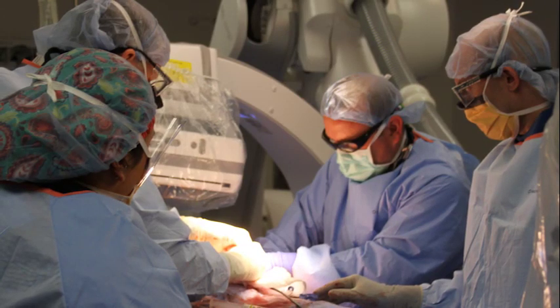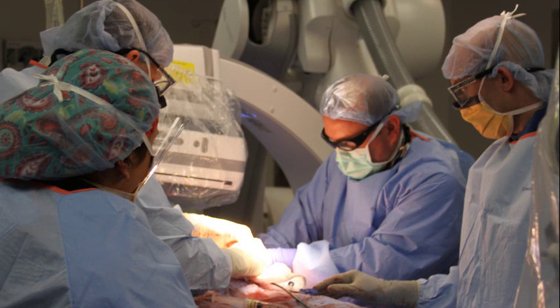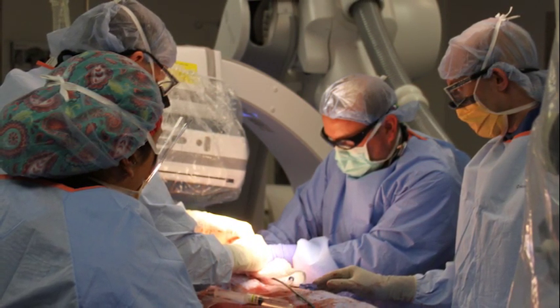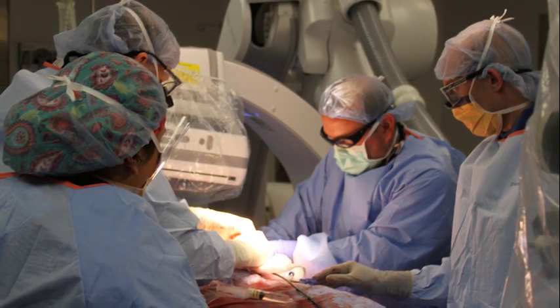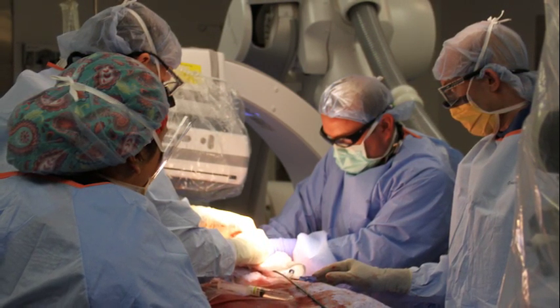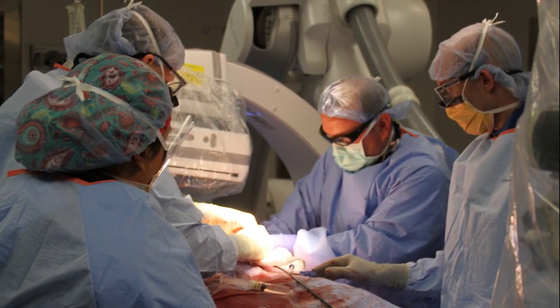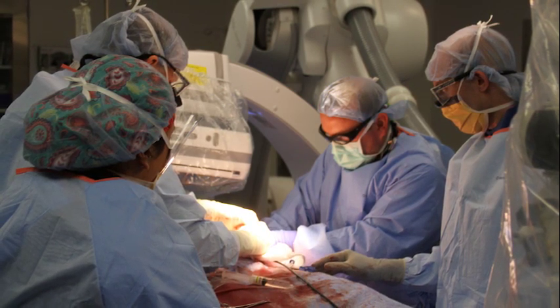A 3-member team during EVAR is ideal: the physician, a nurse, and a radiology technician who can assist in running the IVUS. Oftentimes, having another physician or physician assistant as first assist is helpful. When general anesthesia is used, an anesthesiologist or nurse anesthetist should be present to manage the ventilator.